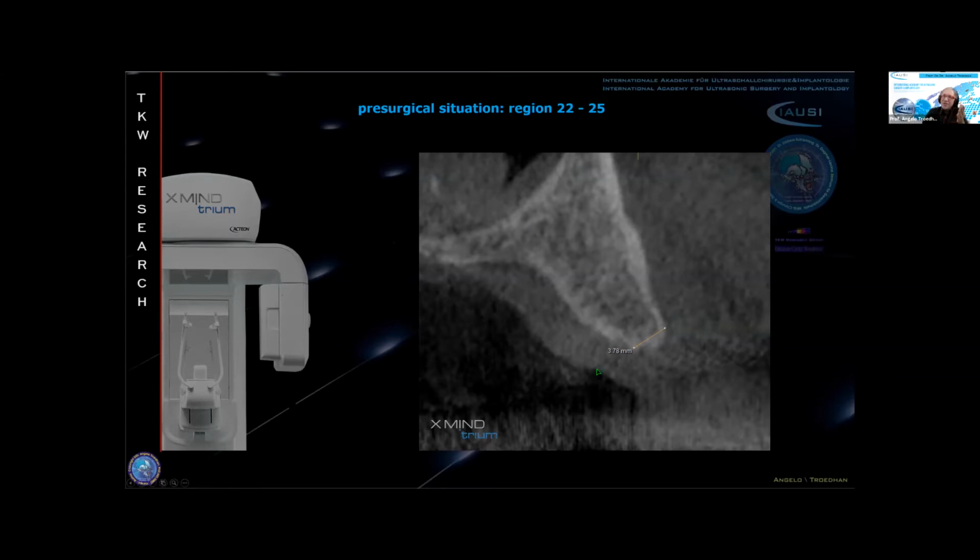And when we take especially this case, we have to consider the fact that we need a 3.5 implant diameter minimum. We need an additional 2 millimeters on the buccal aspect and another millimeter on the palatal aspect. So in this case, of course, we need to do bone augmentation to apply a sustainable implant, which hopefully will stay there for at least 20, 25 or 30 years.